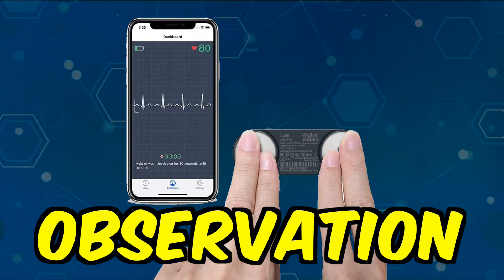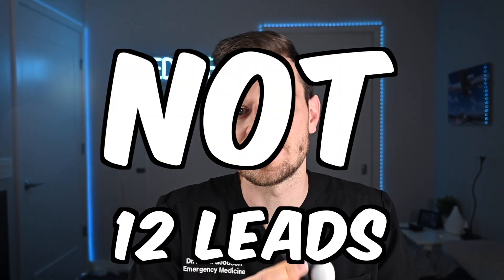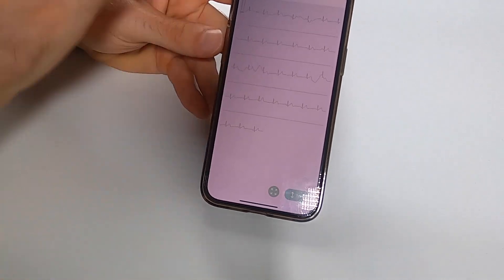Last, the EKG rhythm strip monitor — I'm going to give this an observation. I think the concept is cool and I get the idea, but I just don't personally see the utility of having a limited-accuracy EKG at home. If you're very worried about an irregular heart rate, you should be seeing your doctor anyway. These are not 12-lead EKGs — they do not evaluate for ischemia, a heart attack, or anything really concerning except atrial fibrillation or irregular heart rate. So is it worth getting one? Probably not. But if you're into it, this one works fine, just like the Apple Watch.